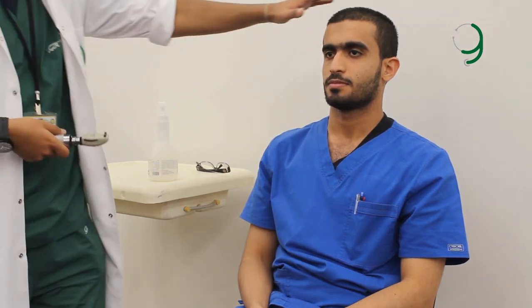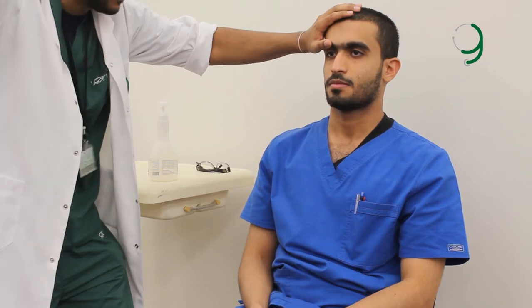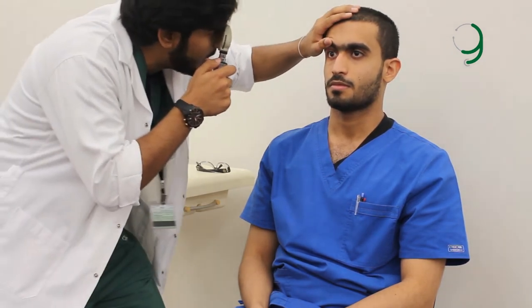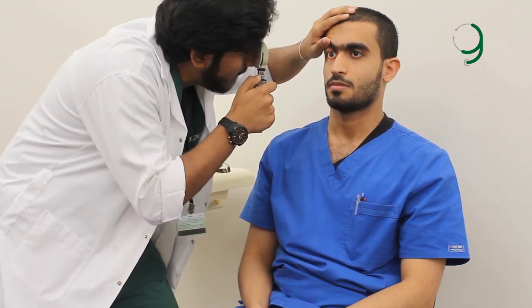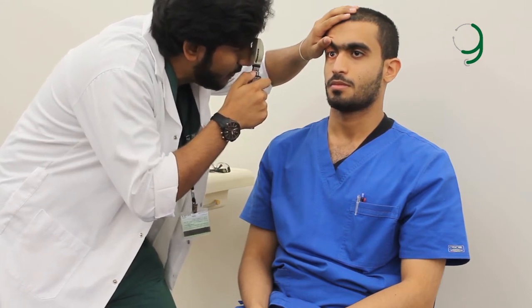Next, you need to use the ophthalmoscope to look for the blood vessels, optic disc, and macula inside the retina. To do that, you turn on the ophthalmoscope and take a temporal approach. Put your hands over his forehead like this. Tell the patient to focus his gaze on a spot on the wall and never move his gaze from that. Then you can use the red reflex to guide you into the retina. Once inside, you will find blood vessels, and once you do, you can follow them back into the optic disc since they converge there. Or you can follow the V-shape that they create.